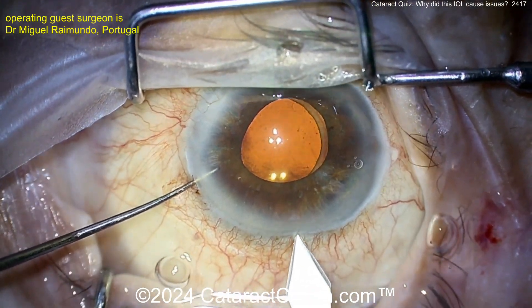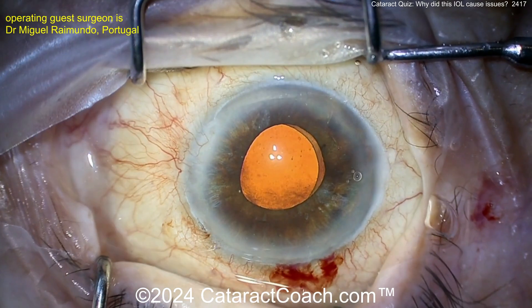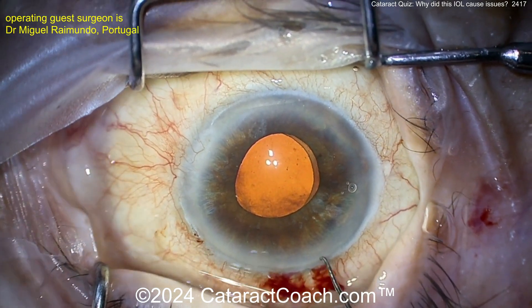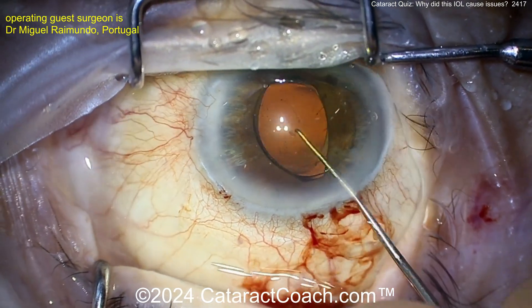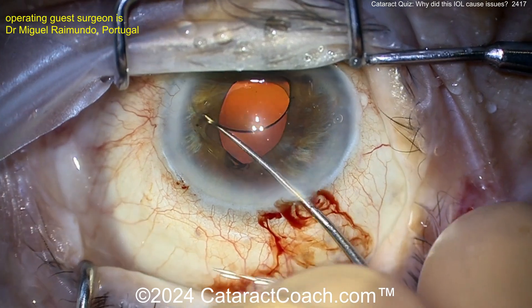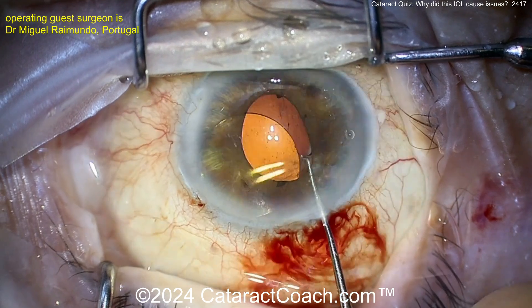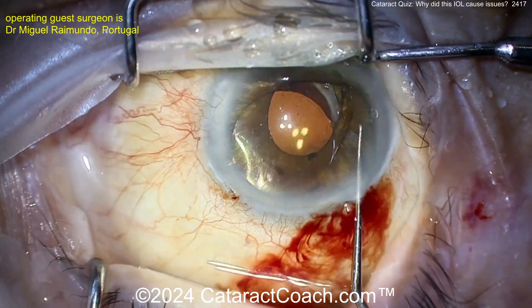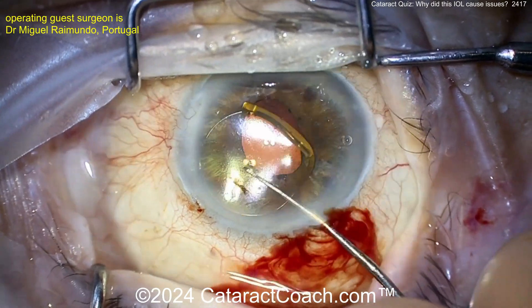A big incision is being made here — so maybe the surgeon is going to explant the lens. That's probably a three-millimeter incision. The lens is being brought up now. I'm not sure why you'd want to explant if you can really open up the bag — you may be just fine getting this lens completely back in the capsular bag, getting that outside haptic that was in the sulcus back into the bag. But here it looks like the surgeon is going to explant.